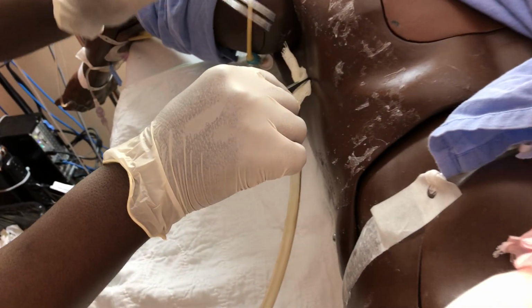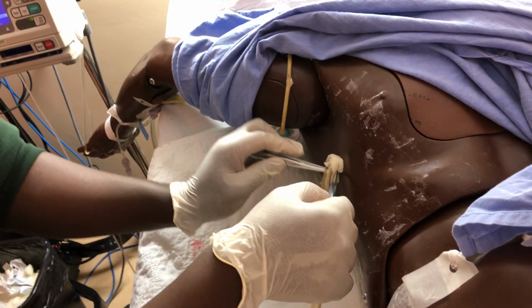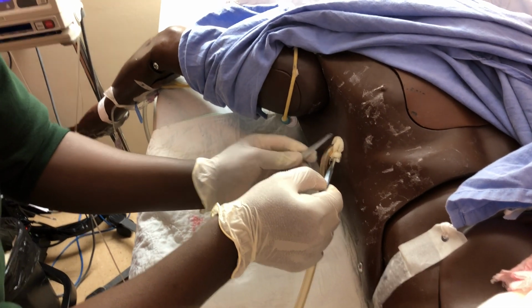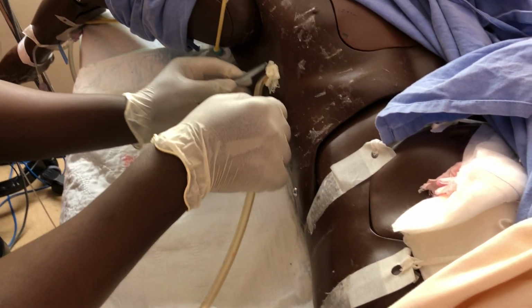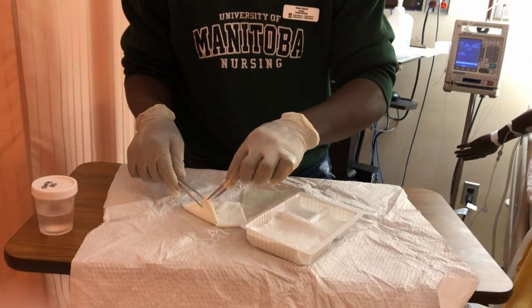So I'll make sure I fully occlude the wound with the Jelonet to make sure no air is going in. You notice there was air coming out of there, so I'm just trying to fully occlude it so that there's no air going in.